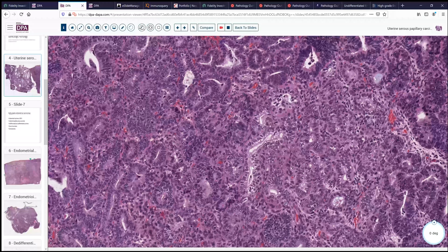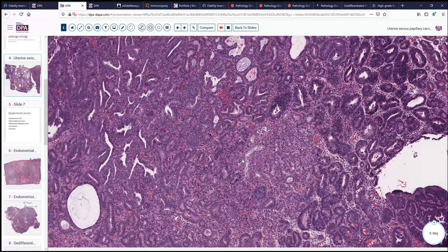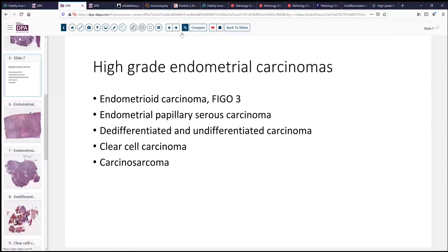Here's another component of the tumor that has a little bit of a clear cell appearance, so sometimes clear cell carcinoma enters into the differential. Now, the differential for high-grade endometrial carcinomas includes endometrial papillary serous carcinoma, and of course endometrioid carcinoma FIGO grade 3, which would be expected to have a glandular component with more than 50% solid differentiation. We didn't see that solid differentiation in our current case, so often this is not a difficult differential because the architecture will keep you from going to FIGO grade 3.